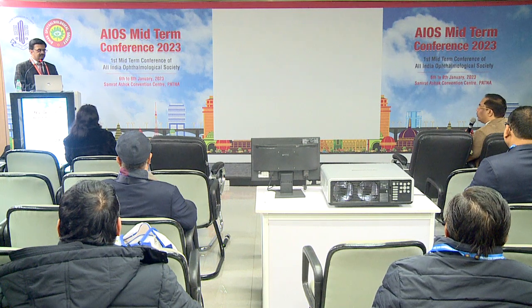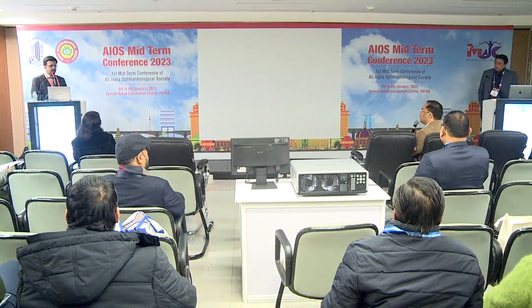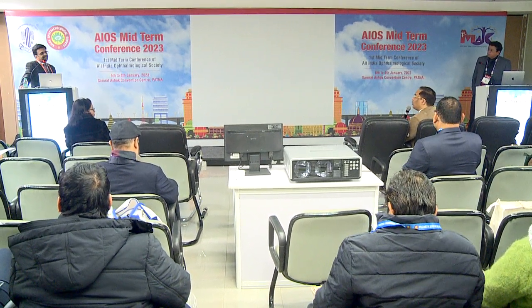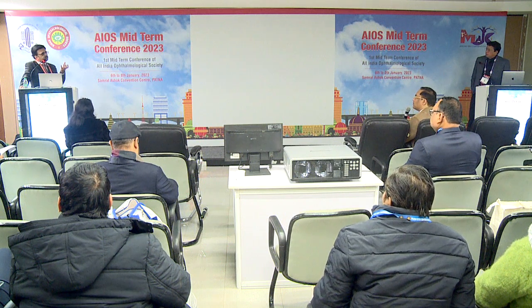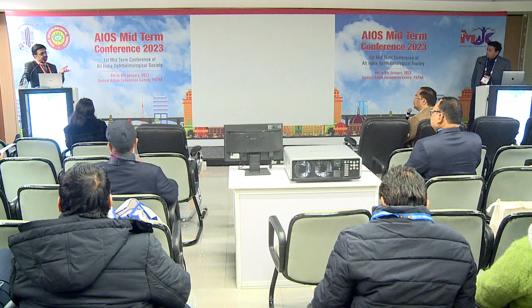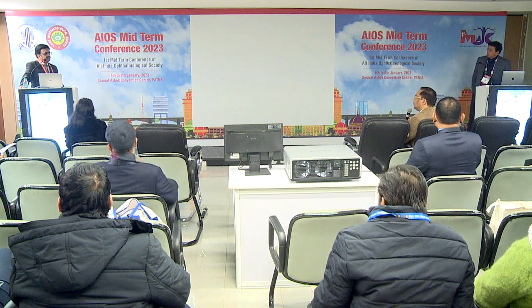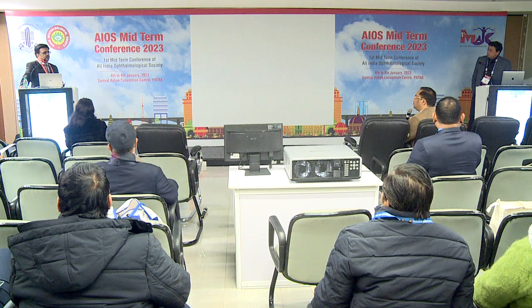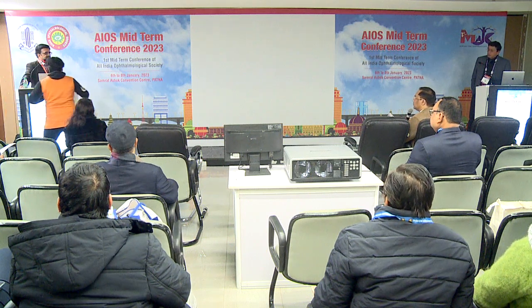Yes. Would there be any role of OCT? Obviously we don't do an OCT for all the cases per se. We do it for the macula, but not for the anterior segment. Posterior polar cataracts in anterior segment OCT, if you see a posterior indentation, there are very high chances that it will give way. But again, when you are operating on a posterior polar cataract, assume that it is going to go. Then your management becomes the same in all the cases.